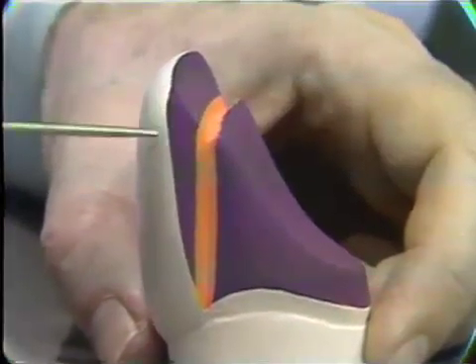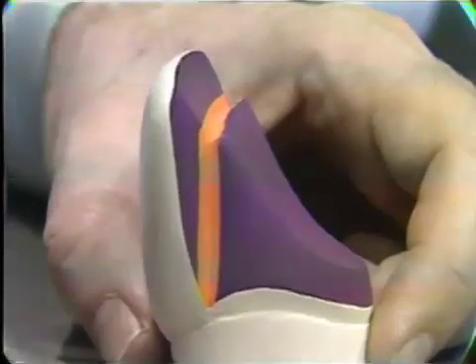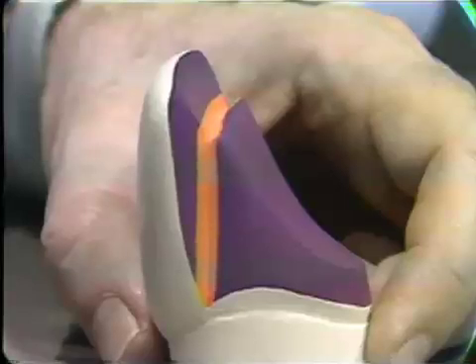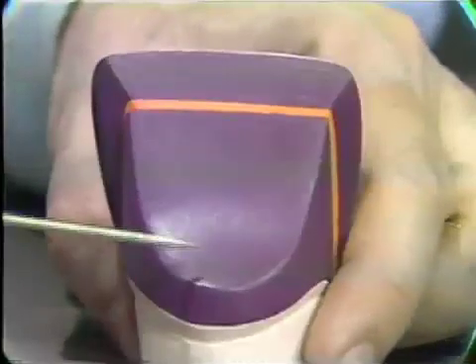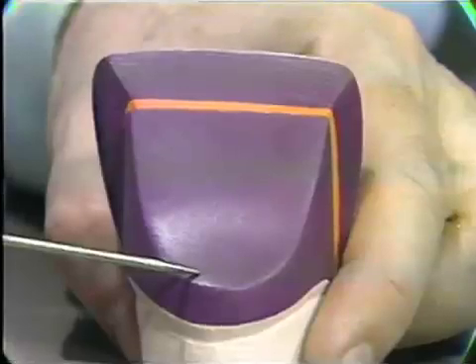Notice the necessary thickness of tooth left in here so that the cement lute on this surface will not show through any translucent incisal edge. Here again, a recess and a pin will be cut here where this is to be used as a bridge retainer.